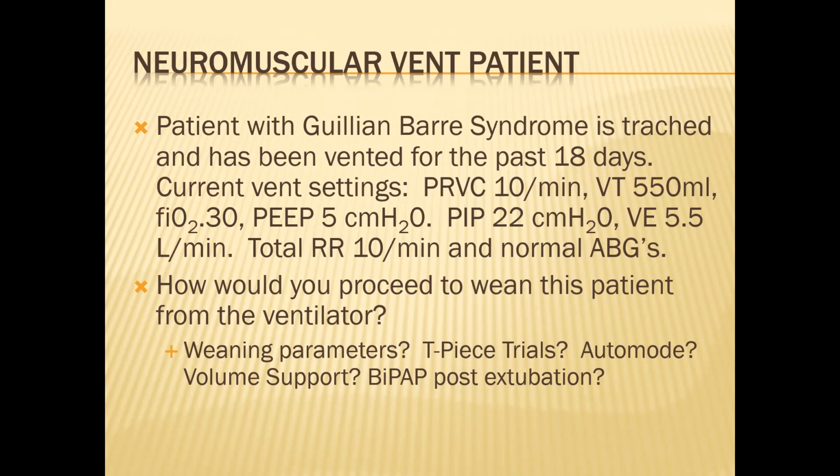So in volume support, if the ventilator is using like 20 of pressure support to give them their tidal volume, you can't really extubate them at that point. So with volume support, you may have to do the extra step. You might have to go from volume support to pressure support with CPAP. Give them just a straight amount of help for each breath and see what their tidal volumes are before you extubate.